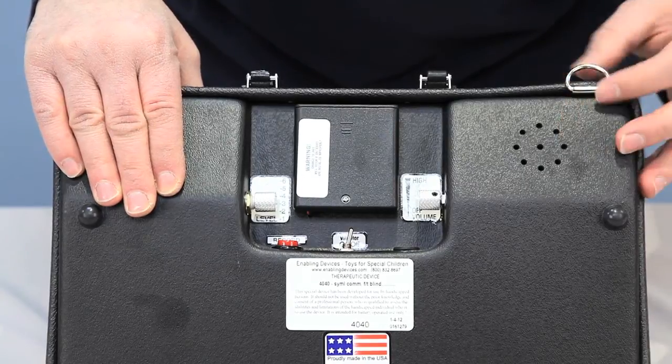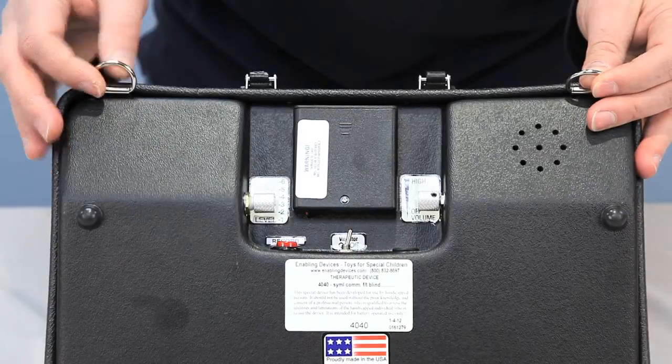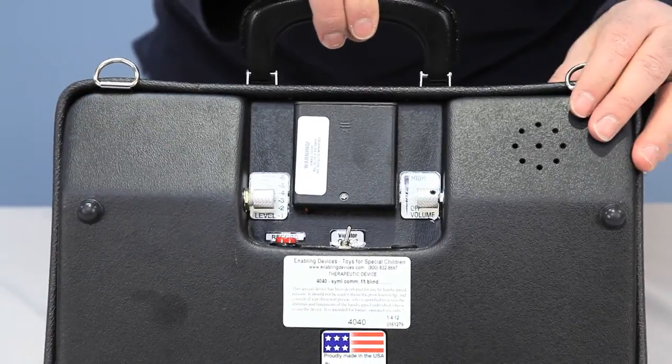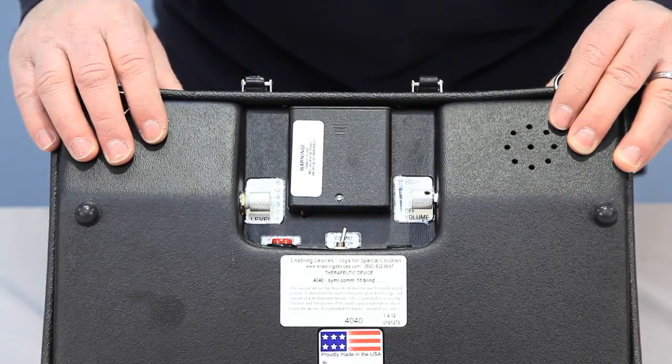This helps the user know they are relaying a message to a caregiver, teacher, or therapist. There are also speakers on the back, two D-rings for a shoulder strap that's included with the unit, and a carry handle.